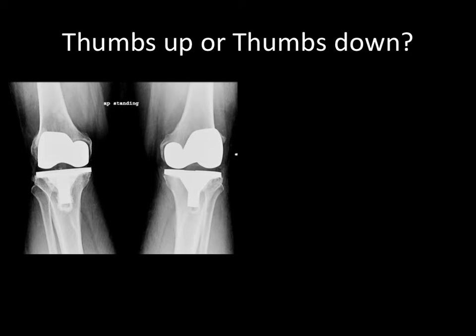Now let's look at some cases. You can pause the video to look at the image and evaluate whether you think the view is adequate or not and why. And then we will review the image. First case.